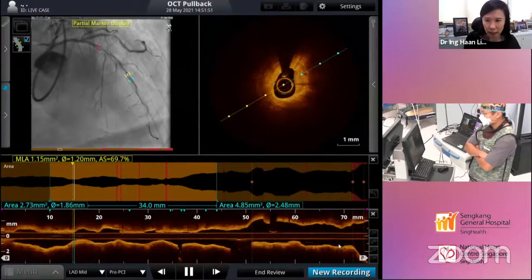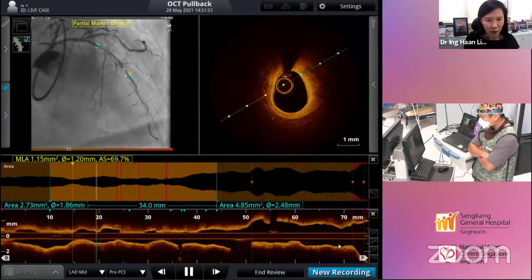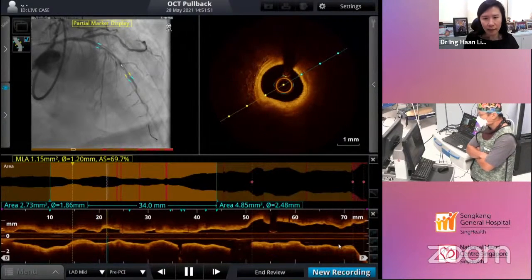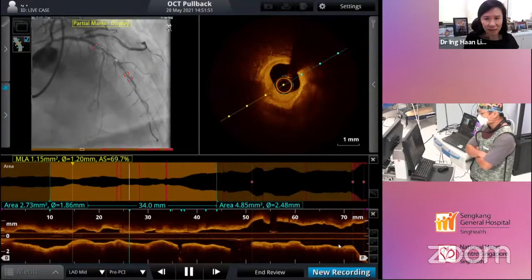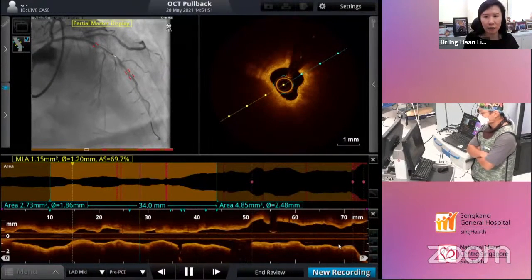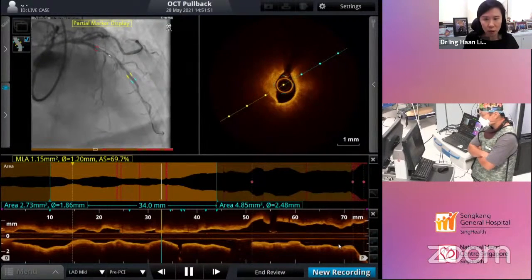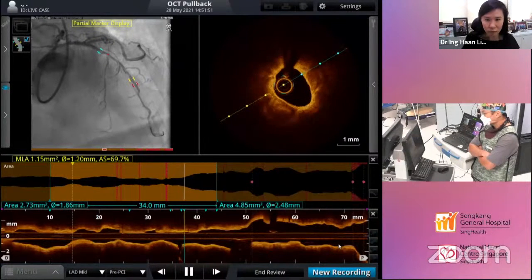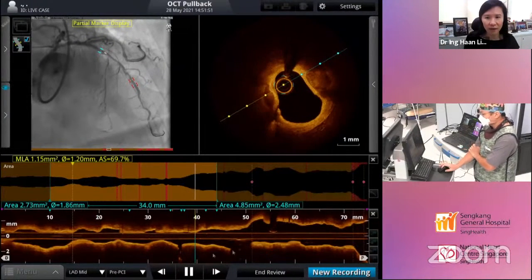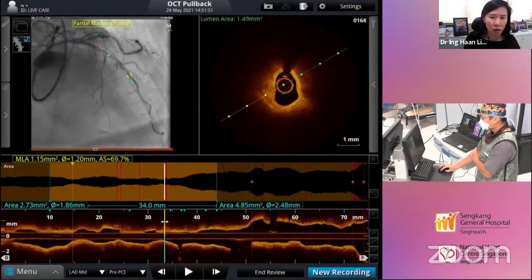I did not see any nodular calcium. There's definitely high plaque burden and high degree of calcification across the vessel, but I didn't see any part where it is napkin ring type of calcium or 360-degree calcium. The vessel itself at the tightest portion, around here, where there's a lot of thick calcium, the catheter tends to be biased towards the calcium.